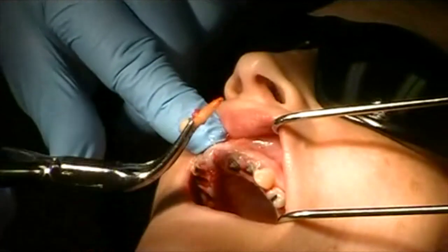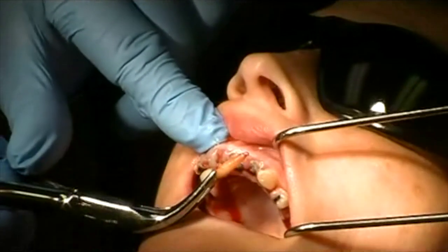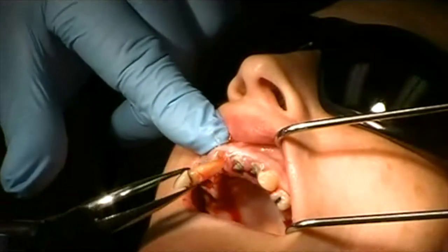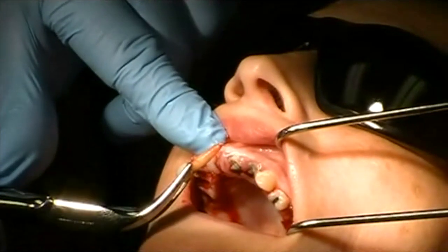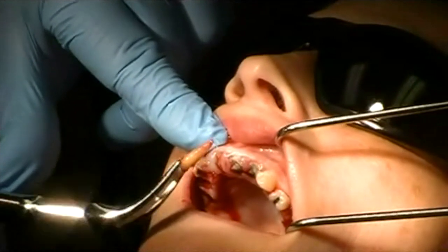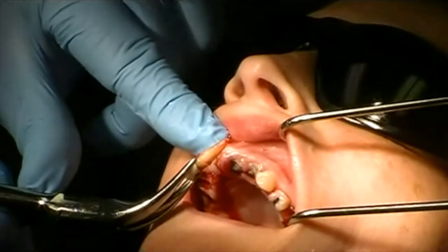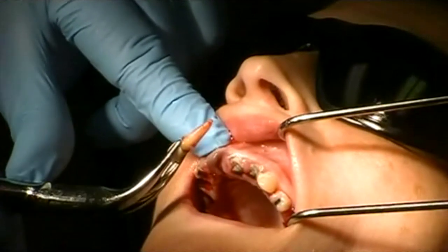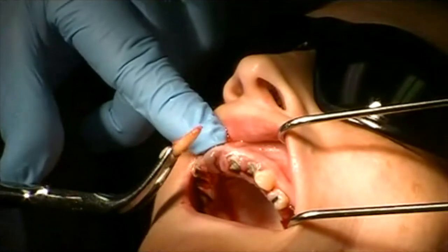You can see we have the tooth taken out — a very long lateral incisor — but we maintained the buccal plate intact. This is very important if we consider dental implants: our extractions need to be atraumatic and we need to maintain that facial bone as much as possible. So, one down — let's keep moving forward.